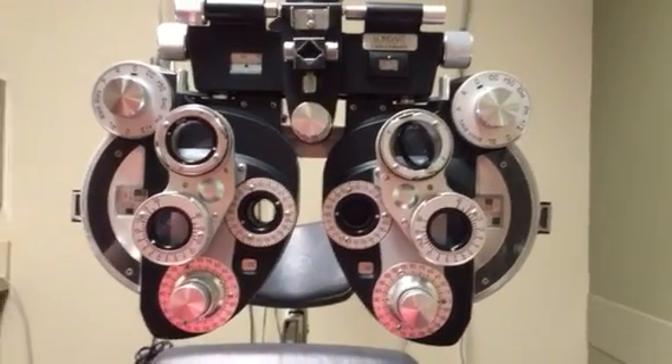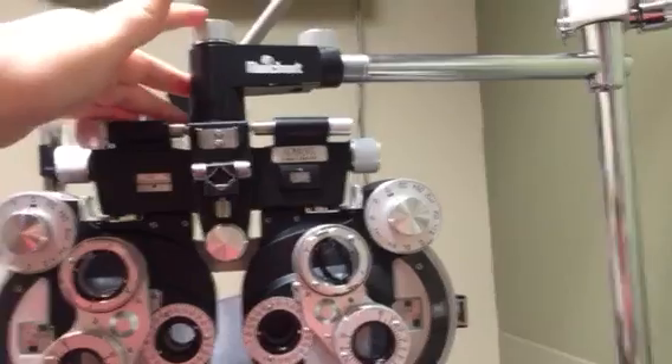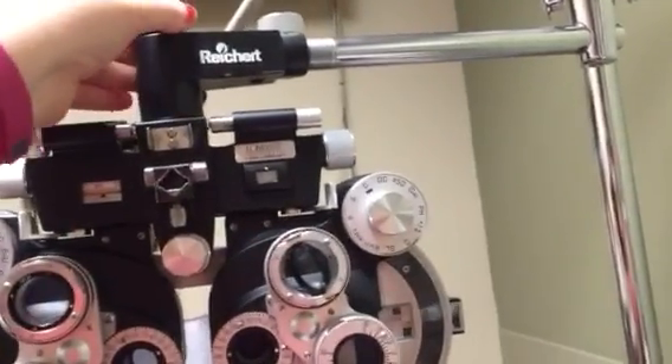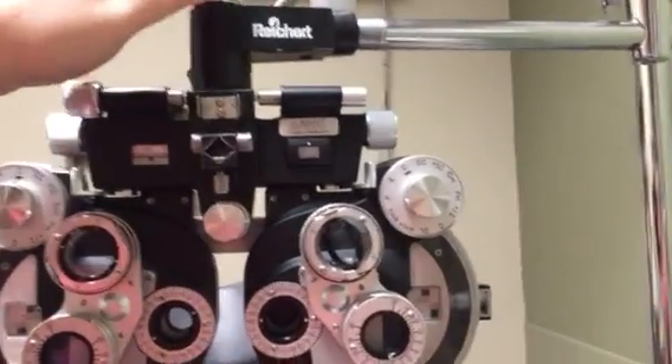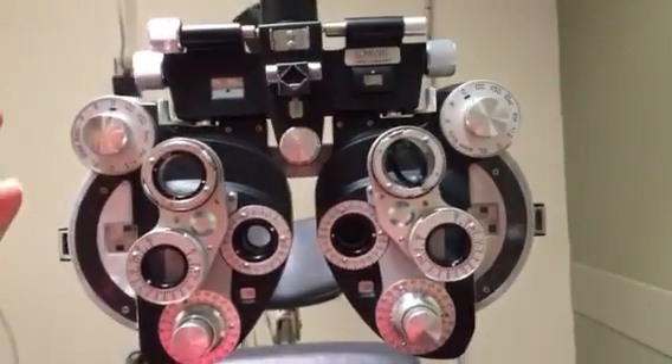Let's go over parts of the phoropter. The first knob up here is to lock and unlock the phoropter. When you're fully adjusted, you want to lock it so it's not going from side to side.